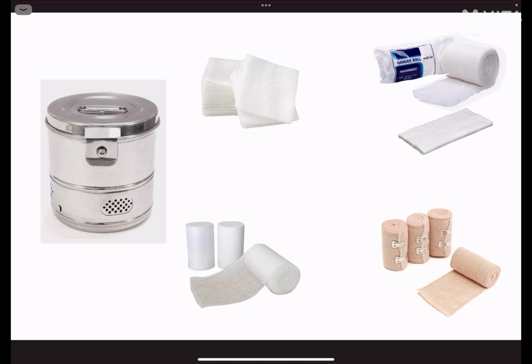Crepe bandage. It is made of cotton, polyester, and elastic yarns. It creates an even stable pressure around the area of application, therefore reduces swelling, and compression bandage also reduces the bleeding. It has hemostatic effect due to the compression. We use it for strapping of the sprain and strain around the joints. We use it for splintings of fractures as in skin traction. We also use it as post-operative compressive bandages.